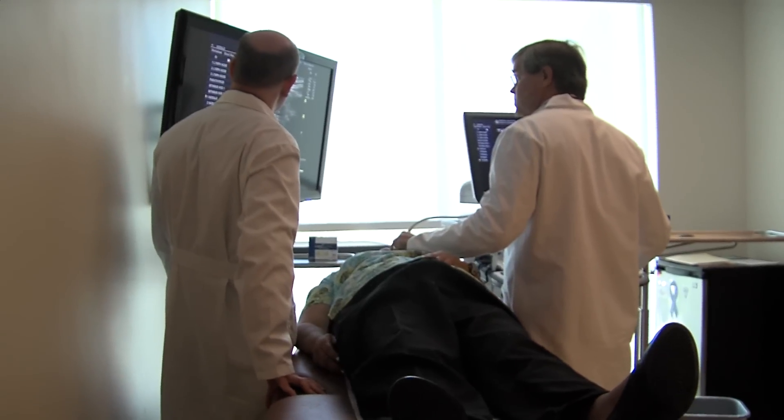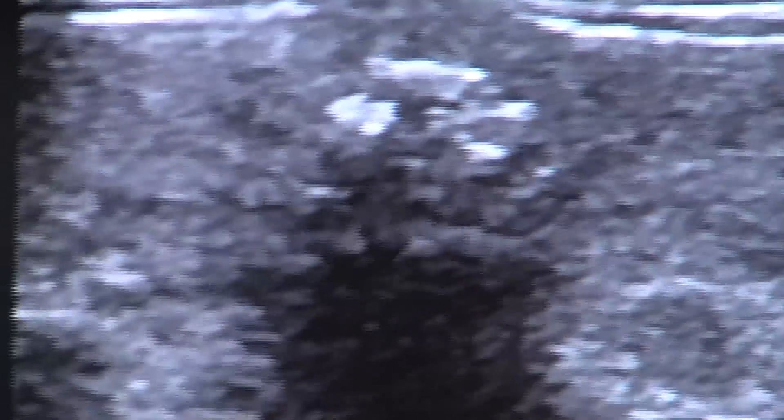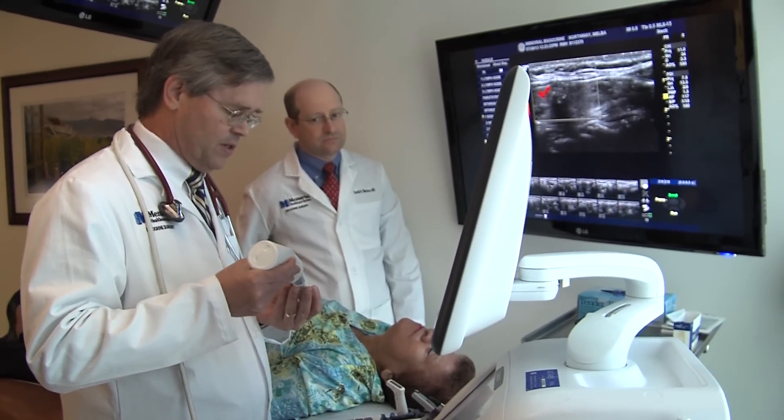The issue on the left here is somewhat hypoechoic and up against the carotid, and this was not biopsied. Do you see how it sparkles as I move the probe back and forth on it? You cannot get that from a single image — it's real-time imaging that makes the difference in figuring out what this is.